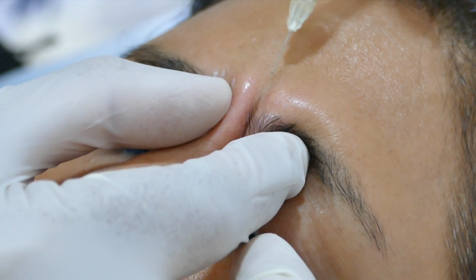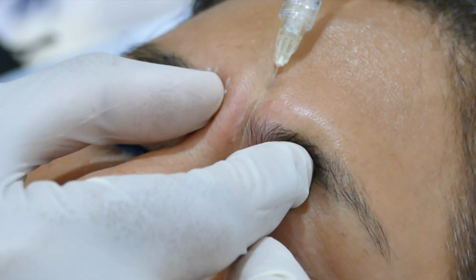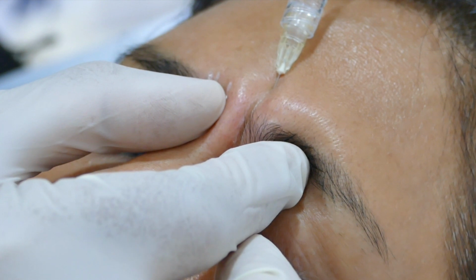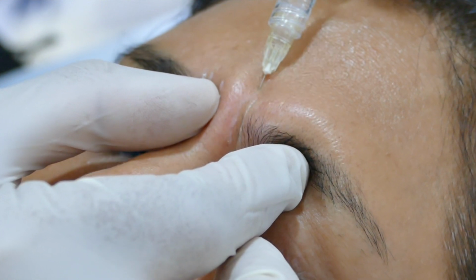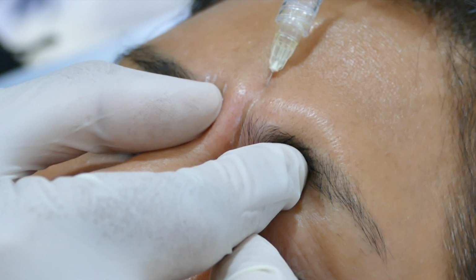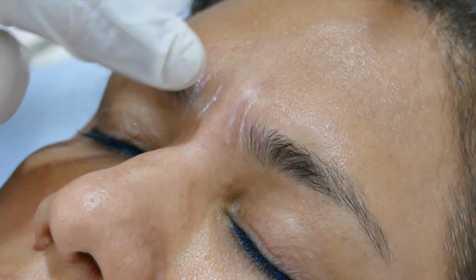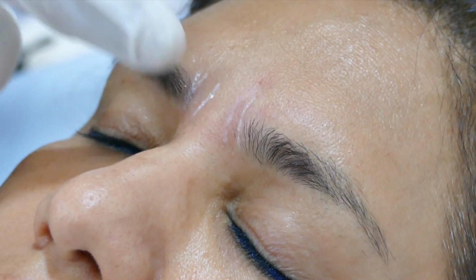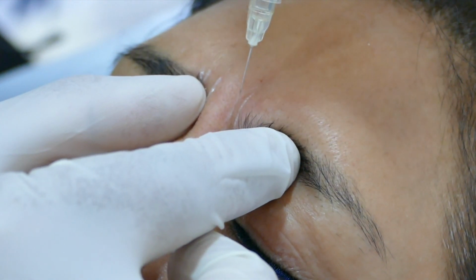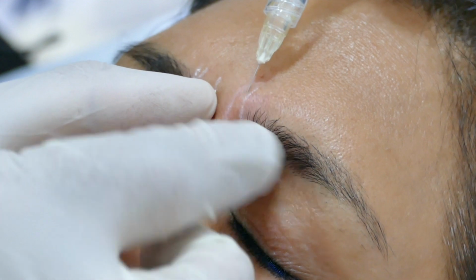And then injection is very superficial. And then gentle massage. Again, very superficial, just underneath the skin.